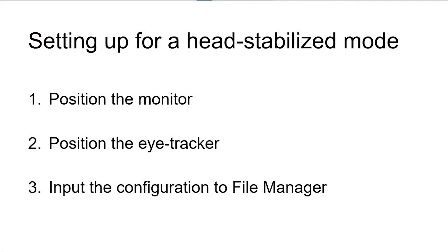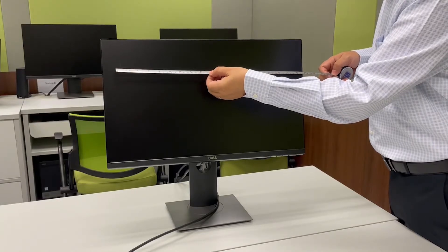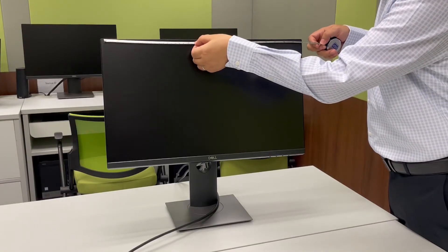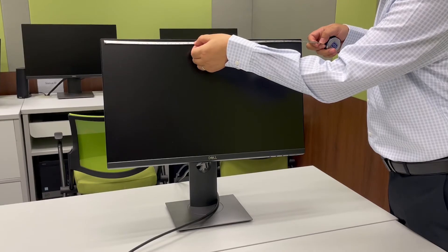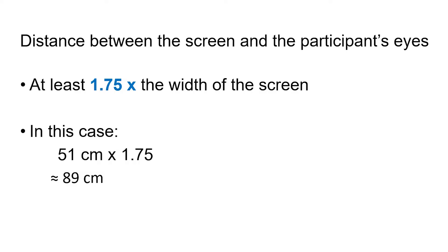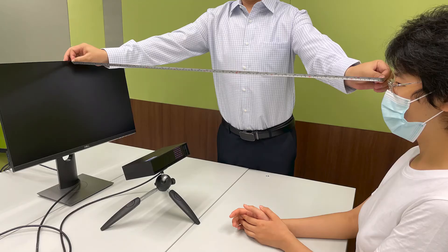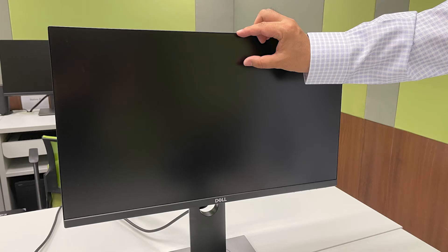There are three steps to take. First, position the monitor of the display PC. Let's measure the width of the screen on the display PC — it's 51 centimeters. The distance between the screen and a participant's eyes should be at least 1.75 times the width of the screen, in this case no shorter than 89 centimeters. A participant's eyes should be at the level of the top quarter of the screen.